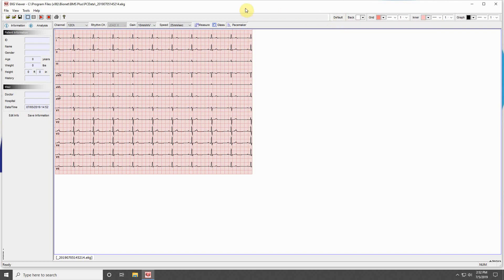The next section will allow you to customize the display of your ECG data. You can adjust number of channels, which channel is the rhythm channel, the gain, and the speed. You also have quick access to the three tools from the tools menu.